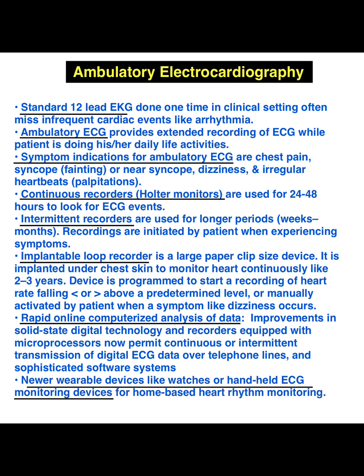The device is programmed to start a recording if the heart rate falls below or rises above a predetermined level, or it is manually activated by the patient when symptoms like dizziness occur. Rapid online computerized analysis of data. Improvement in solid-state digital technology and recorders equipped with microprocessors now permits continuous or intermittent transmission of digital ECG data over telephone lines and sophisticated software systems.